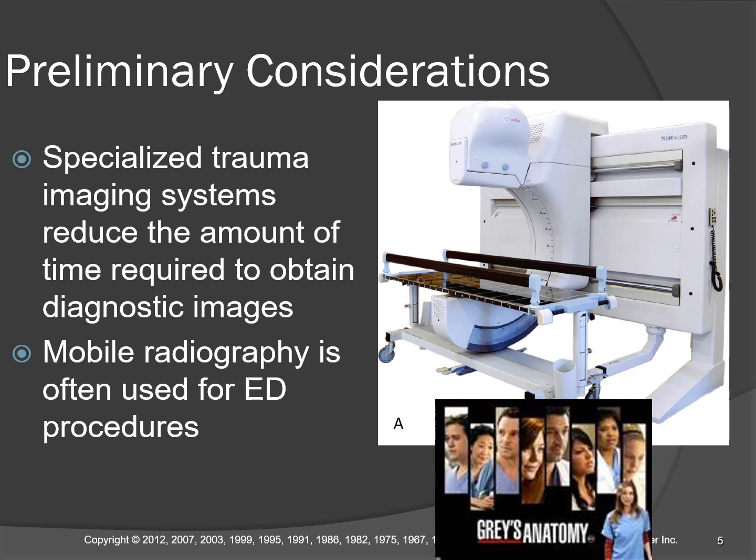So most x-ray techs examine trauma with a conventional portable radiographic unit. We'll be using the portable unit to practice in the lab, and I will show you some things you can do with it that are very difficult to do in a conventional exam room.